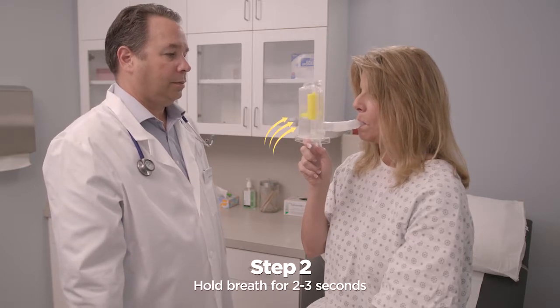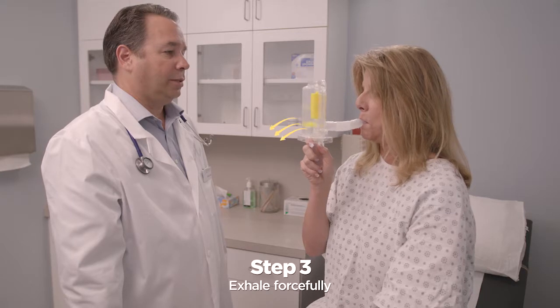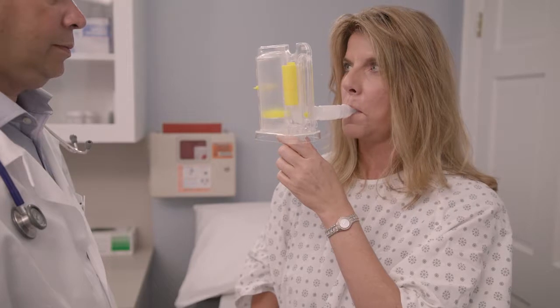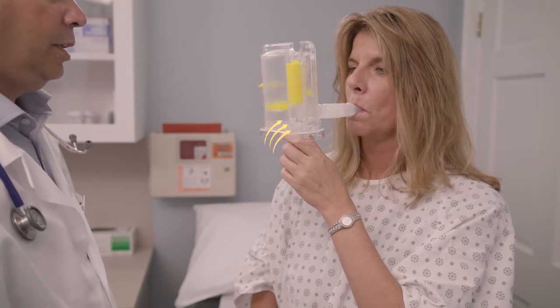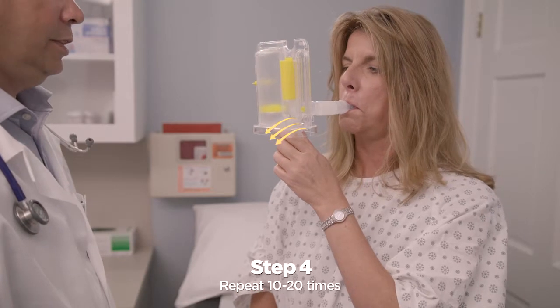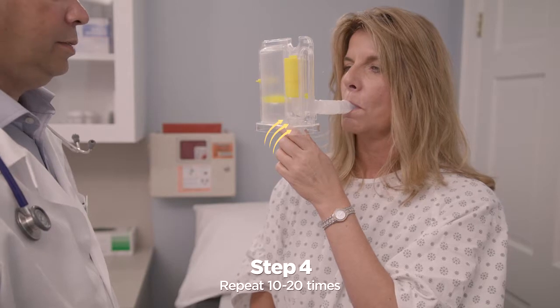Hold your breath for two to three seconds. Breathe out through the mouthpiece with more force than normal. Keep your cheeks flat and not puffed out — this will help you get the best from your treatment. Keep taking very slow, deeper breaths in and breathing out with more force than normal through the IPEP, 10 to 20 times.